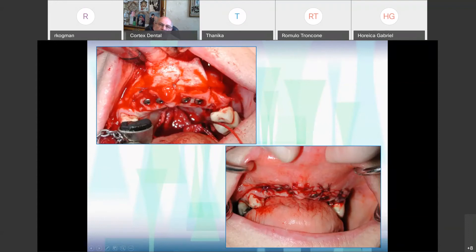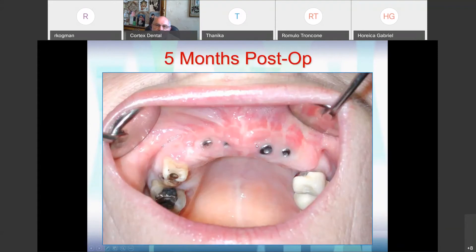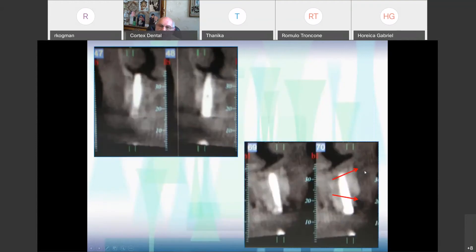It's a membrane to the soft tissue. It's easy because I did the transmucosal approach — I left the healing caps, and you can see them here. Look at the amount of bone we gained.